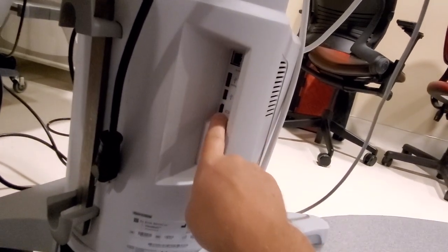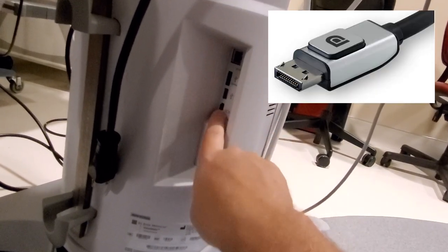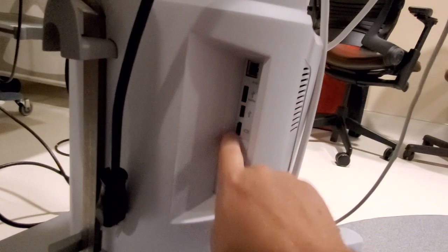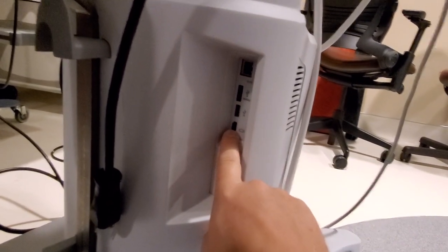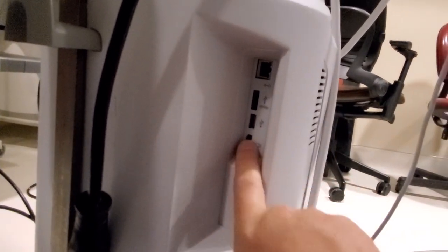Now, I love seeing HDMI on devices. Yes, it's a problem because it doesn't have any fastens, like DisplayPort has the little fasten pawls. HDMI doesn't. You plug and unplug it. It is what it is. But HDMI is cheap. That's why we like using it. If you break the cable, it's not a huge, huge loss. I mean, at the most, let's say it's $60 for a very expensive HDMI cable. I don't feel so bad about that. But HDMI ports are the weak point.